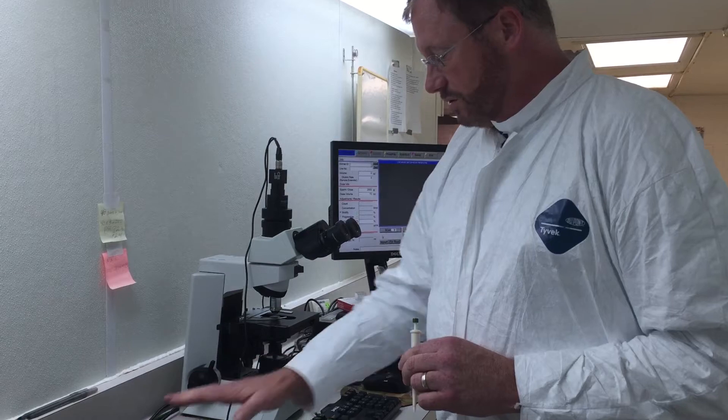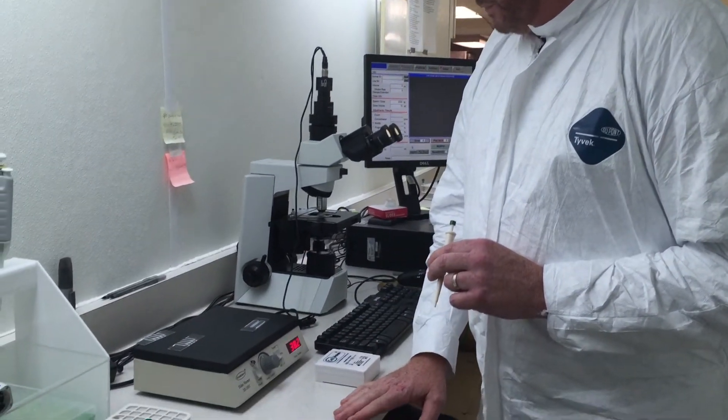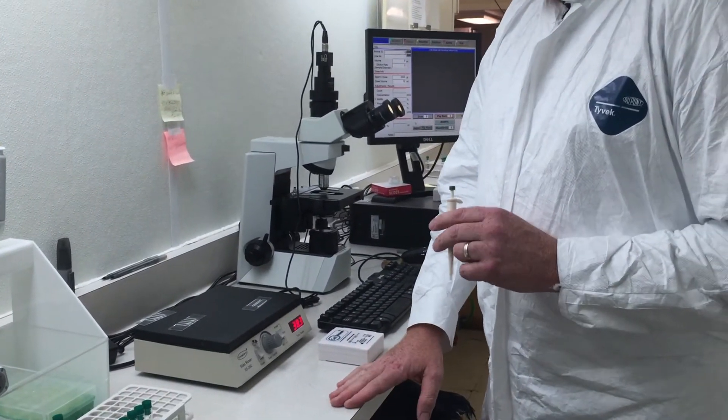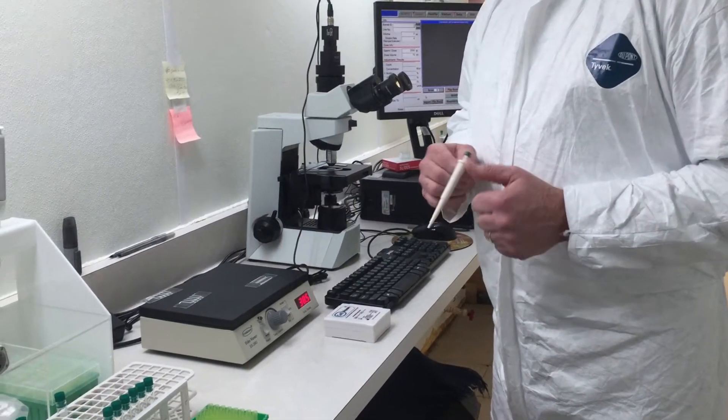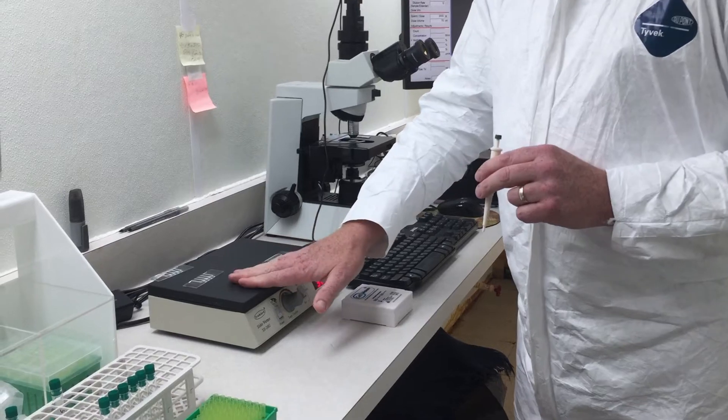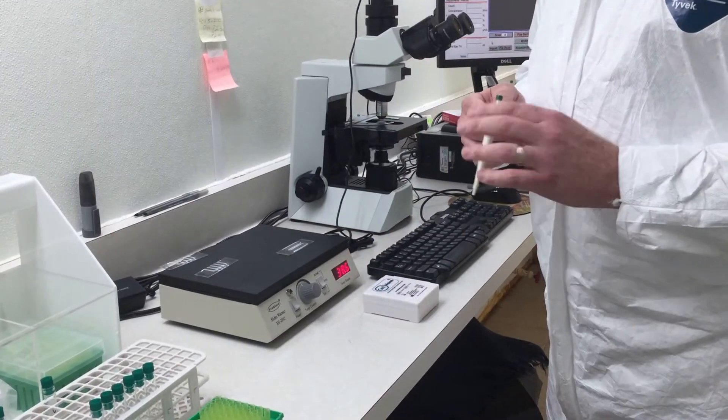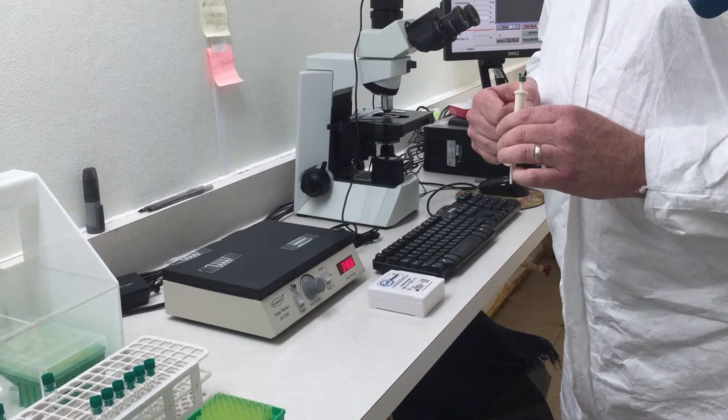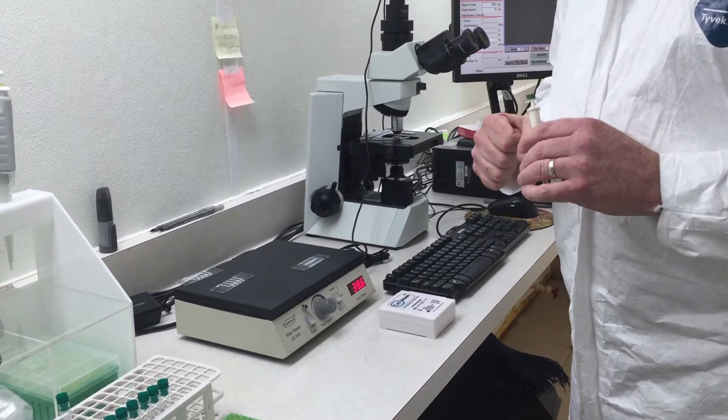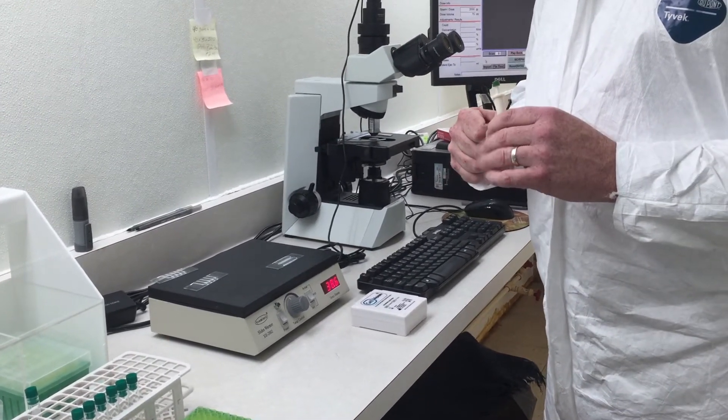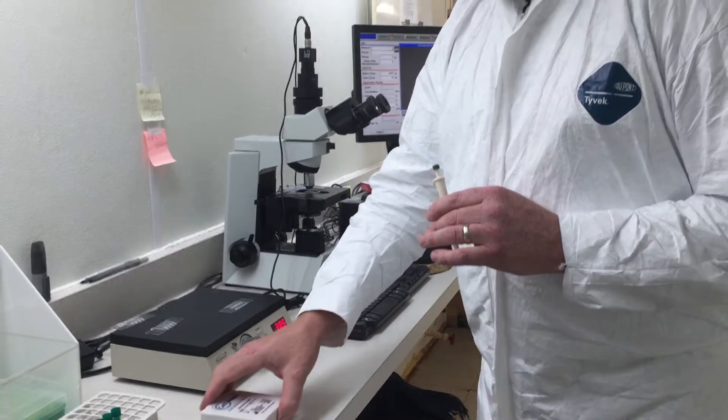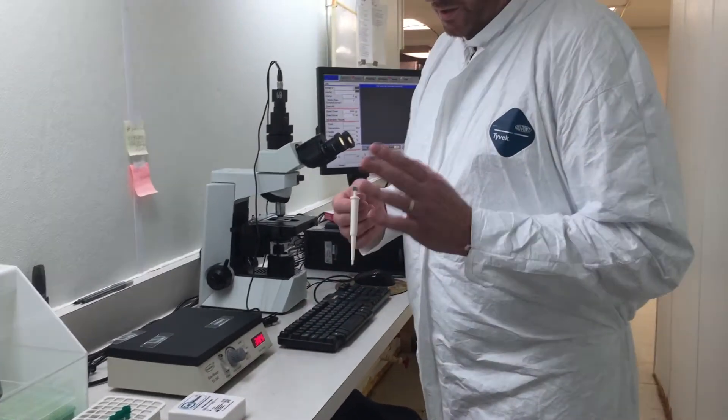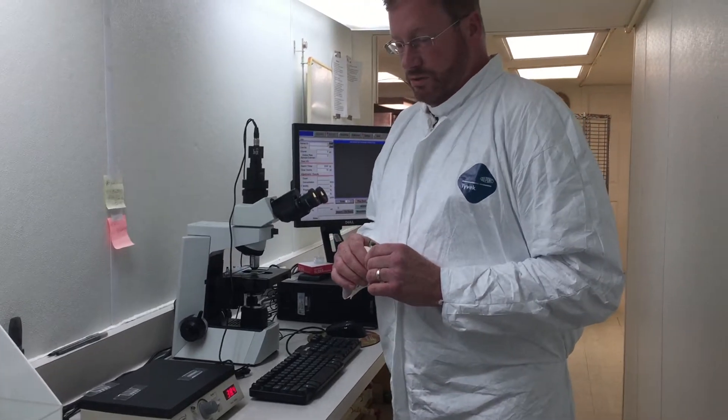We're also using a slide warmer. It's a good idea to have a heat source to warm your sample or the Cell Vision slide. If you don't have a slide warmer, you can use a simple electric heating pad or chemical heating pads. Anything that brings the slide up to body temperature will be helpful, especially in analyzing the motility of the sample.